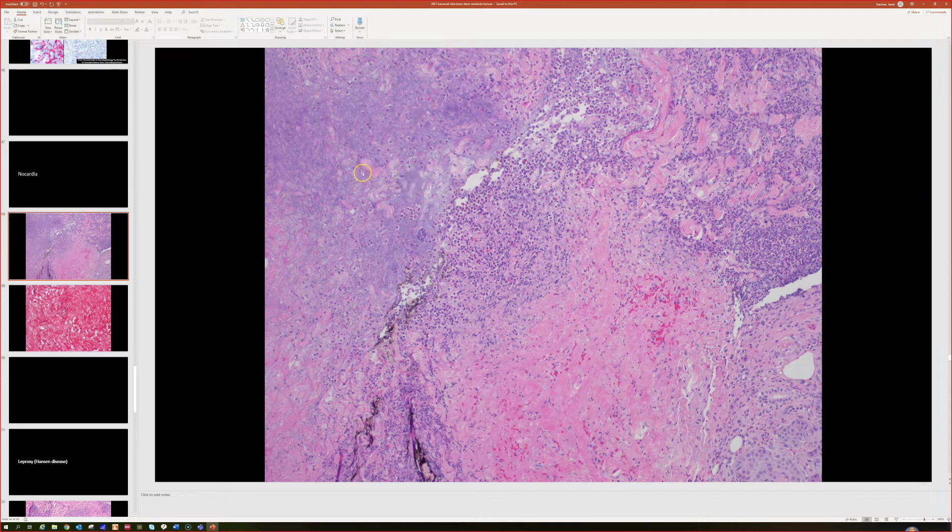Here was an example I saw. This one had extensive necrosis and tons of neutrophils, so it obviously looked like infection. This patient had multiple ulcerations of the leg — I think they were immunocompromised, but I can't recall the exact story. So we were obviously highly suspicious for infection in this case.